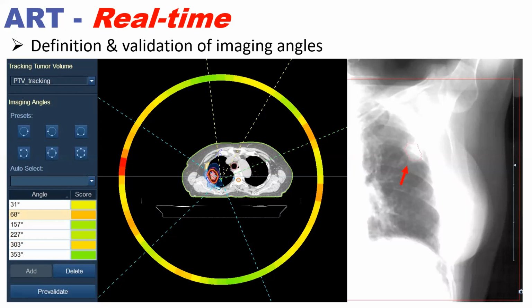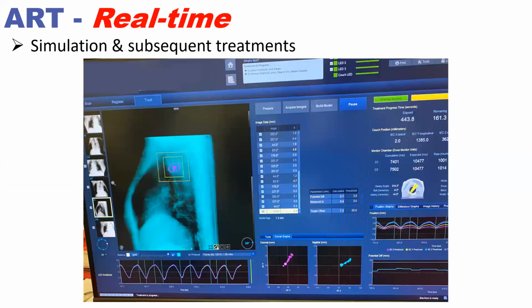What's it doing in there? We'll get back to it, but it's essentially doing an evaluation of the gray values in the pixels here, but it's proprietary. This is not something that they share with you, at least I haven't seen. And when I asked people inside the company, I wasn't given any good information. So this is an interesting aspect of really what it's verifying here.